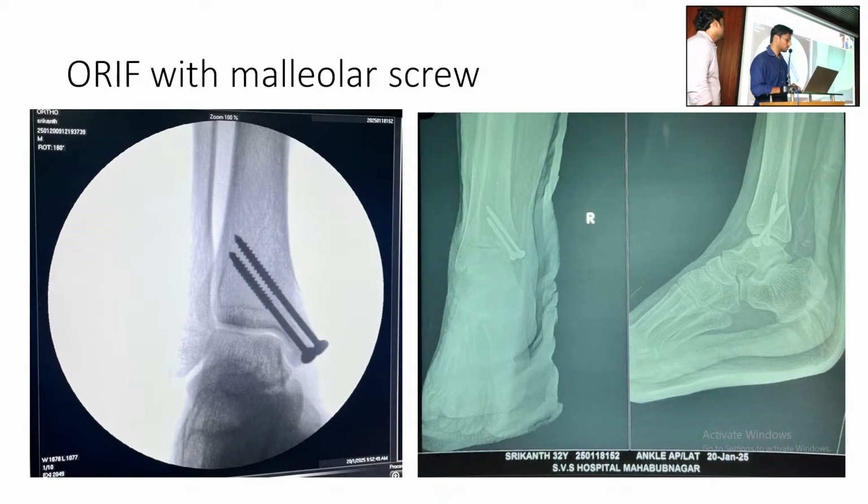When the diameter at the fracture site of the screw is less than the threaded portion, it is a loose screw at the fracture site, so that when the screw is tightened the near fragment gets compressed against the far fragment, thereby producing compression. That is what is called the lag effect. The diameters are different between the shaft and the threaded portion.